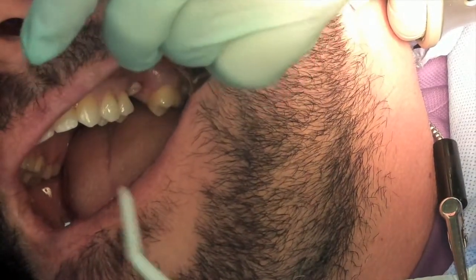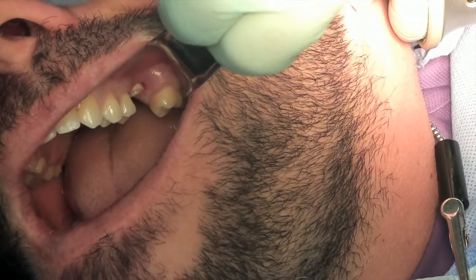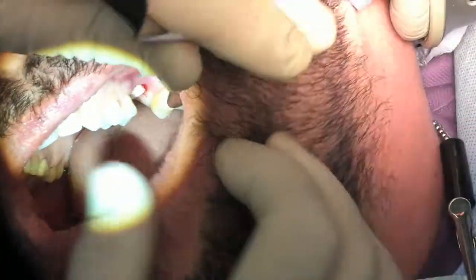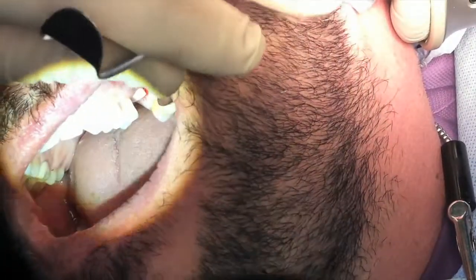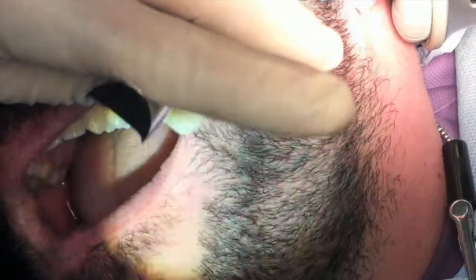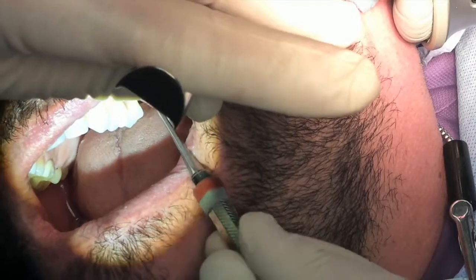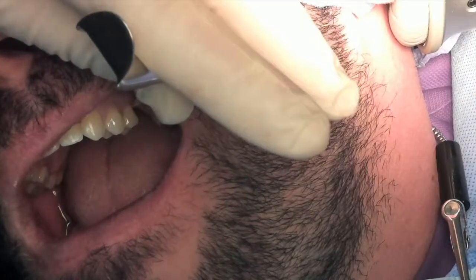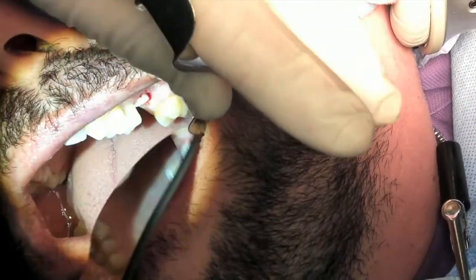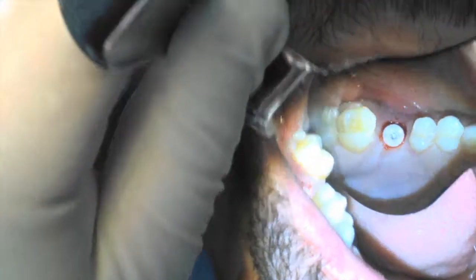Sorry about that. I put this here. Put this over here, wrong place. Okay. And I'll take the mirror one more time. Our implant collar is in ideal position. Now what we can do here is, we'll take a look here first. All right. There's our implant positioning, from the facial.